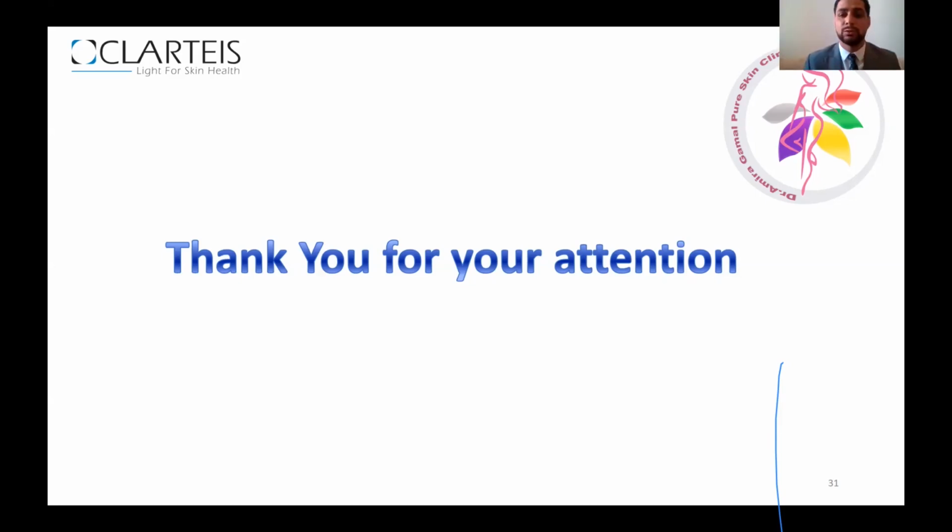Can we do microneedling and Exciplex in the same session? Just to make it clear to all the participants, what are the protocols when you do this combination of laser CO2, Exciplex, and topical or microneedling? We have two types of combination. First, you do the session of Exciplex, then the fractional laser, then you apply the tacrolimus. Second, you do the Exciplex, then microneedling, then you apply the tacrolimus. These are the three steps in the combination: light, then the fractional laser or microneedling, then the tacrolimus.